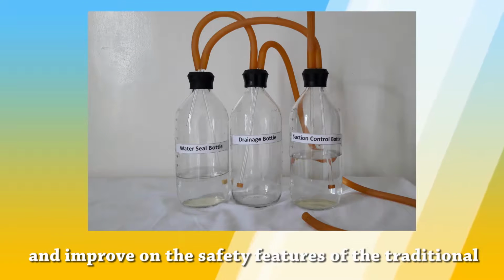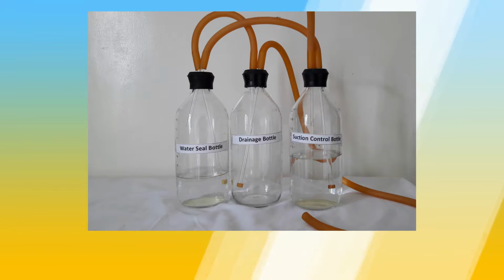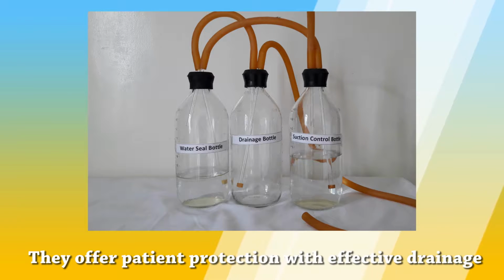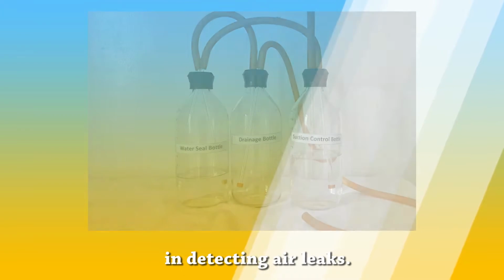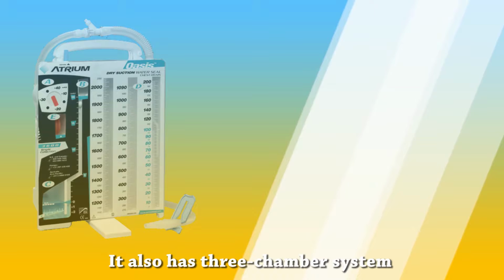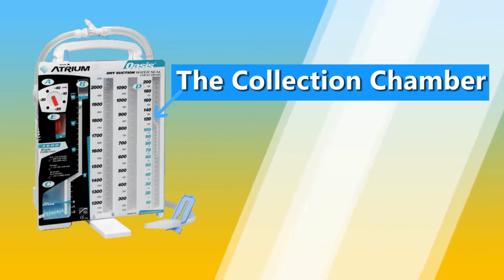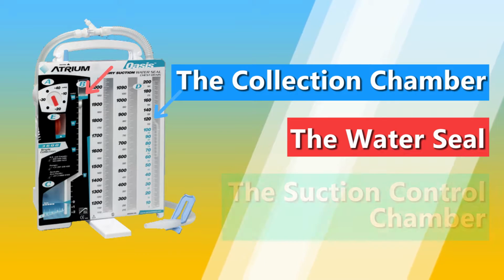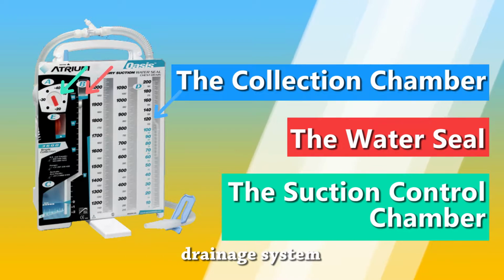The kits are designed to incorporate the functions and improve on the safety features of the 3-bottle drainage system. They offer patient protection with effective drainage, accurate fluid loss measurement, and assistance in detecting air leaks. It also has a 3-chamber system: the collection chamber, the water seal, and the suction control chamber, which have the same function as the traditional water seal drainage system.